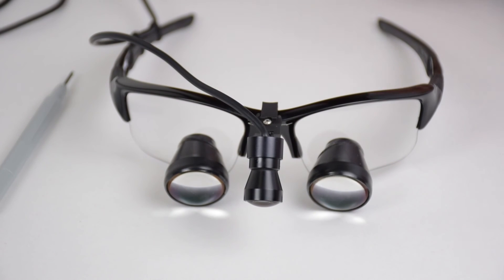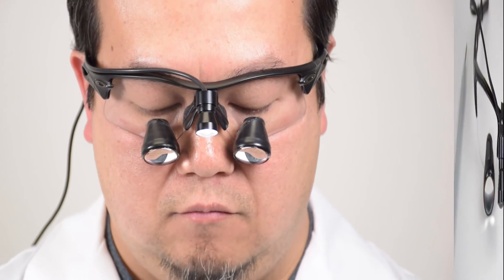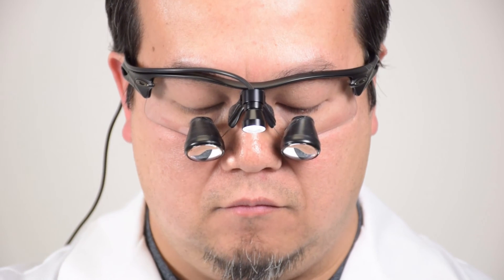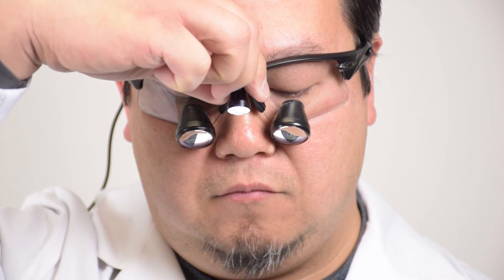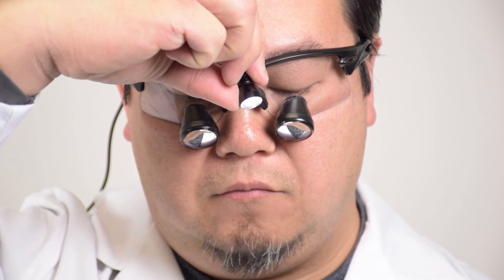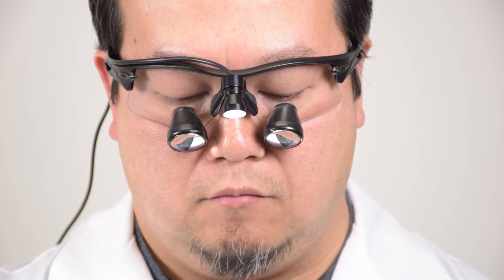If your light is still out of alignment, or if your light adapter cannot be adjusted, put on your loops and observe a target. With one hand, reach up and bend the headlight left or right to adjust the beam. Be careful not to apply too much force, as you can possibly disconnect your light from your loops.